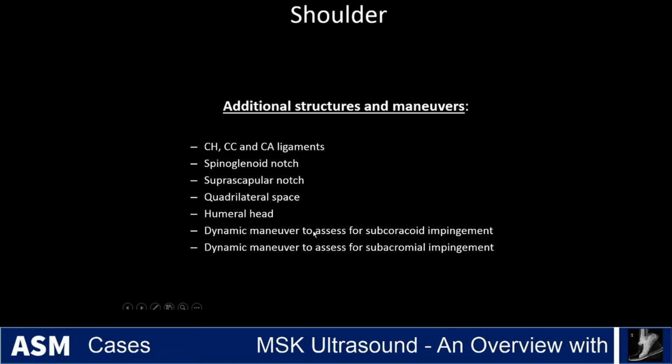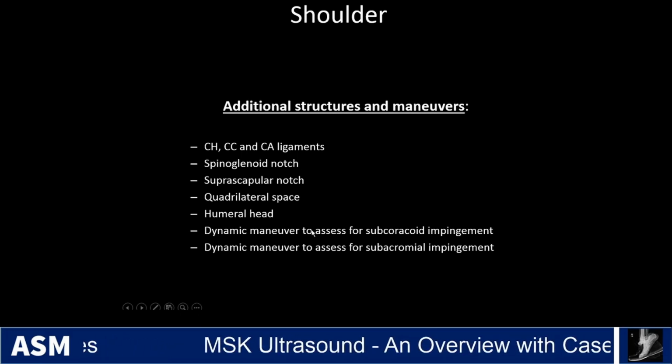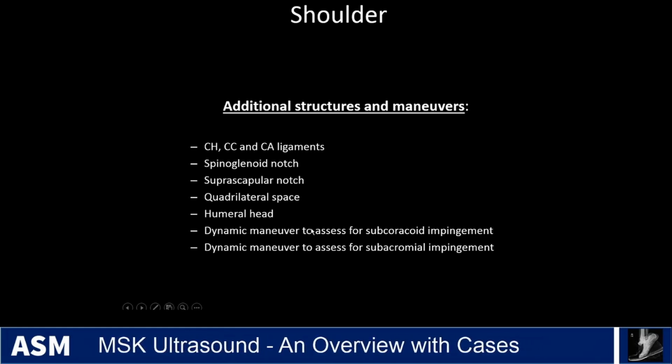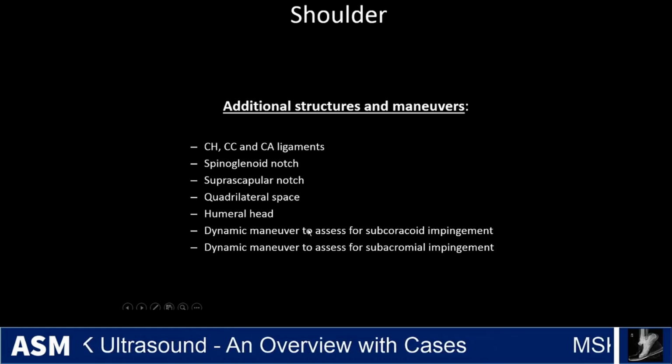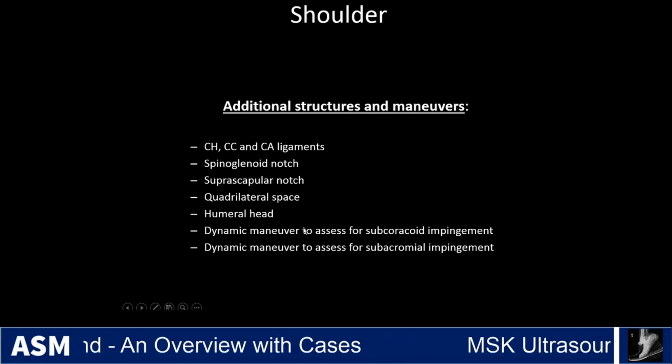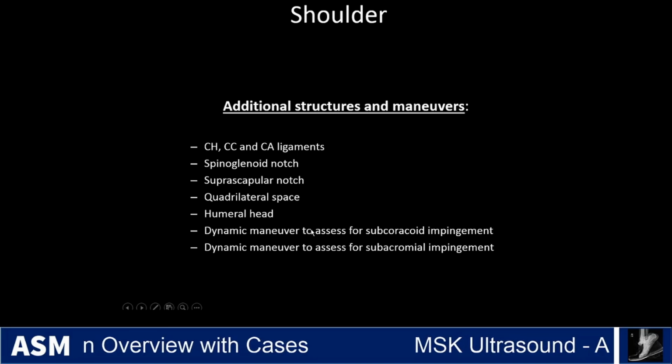So as you have the patient internally or externally rotate their shoulder, the humerus that is, or you do it yourself, you can watch, and if the tendon has torn and retracted, you're going to see the stump sort of waving back and forth, but it won't be going all the way down to the footprint where it should be attaching.